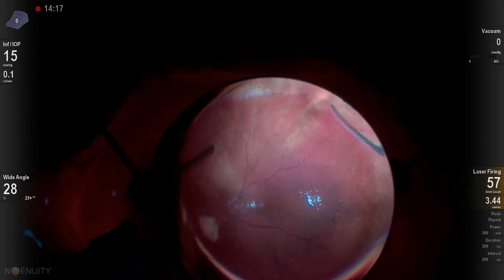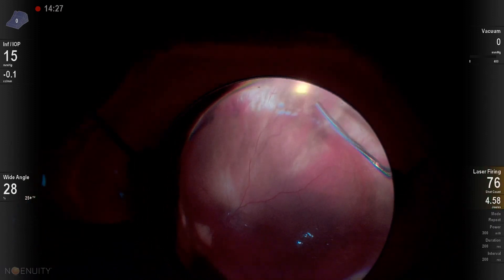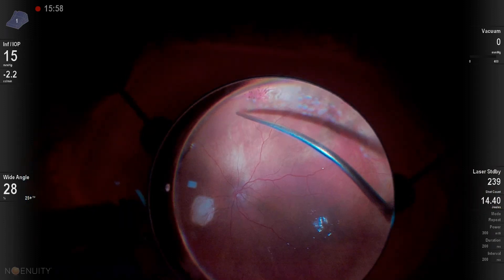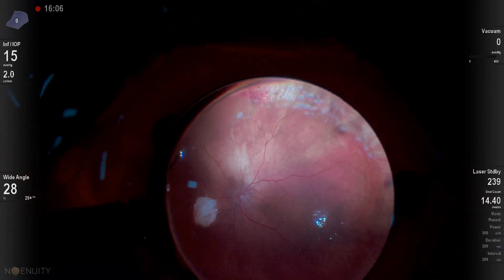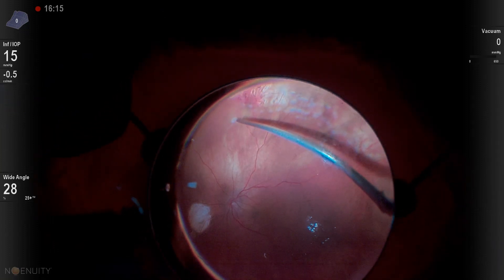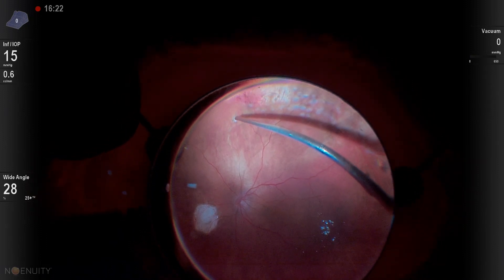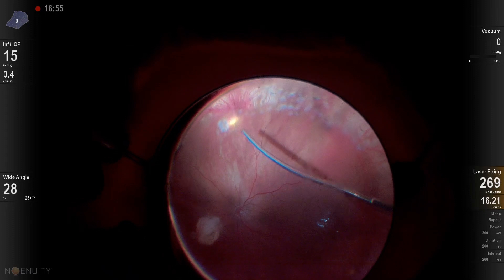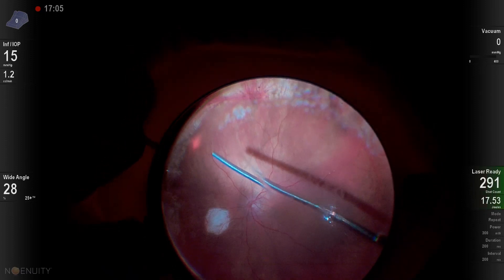I'm thinking I'm going to leave this perfluoron in the eye. I felt like that constant tamponade with perfluoron would flatten that very peripheral localized retinal detachment out. But I had some trapped fluid that was more posterior to the previous laser, and in that case I was worried this could be stiff retina, so I created a draining retinotomy. Here I go in with my soft tip on gentle aspiration under perfluoron, just going to gently aspirate to see if that was stiff retina or if it would actually flatten under the PFO. It turned out it was just trapped fluid — not stiff retina.